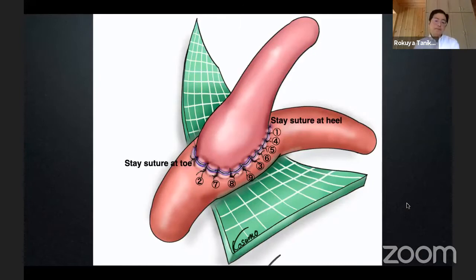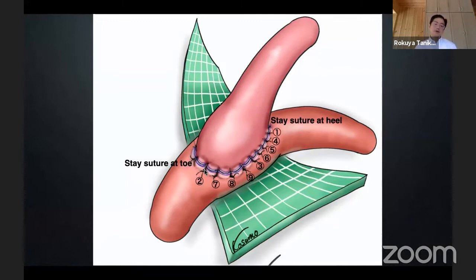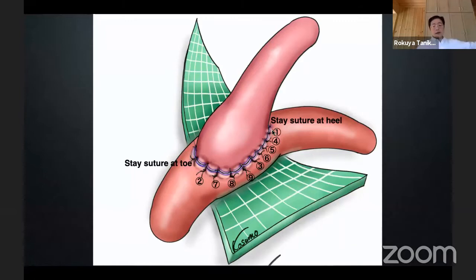This is the stitching order I am currently using: after the stay sutures at heel and toe, the first stitch is placed just next to the heel-side stay suture. The second stitch is at the toe-side stay suture. Then the intermediate stay suture is placed in the middle of the arteriotomy. Then you continue stitching, resulting in nine stitches excluding stay sutures.